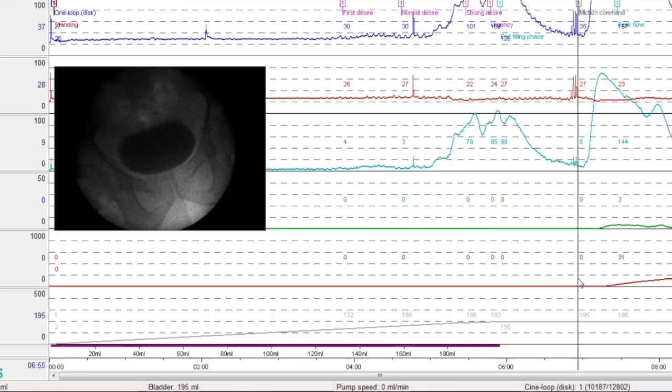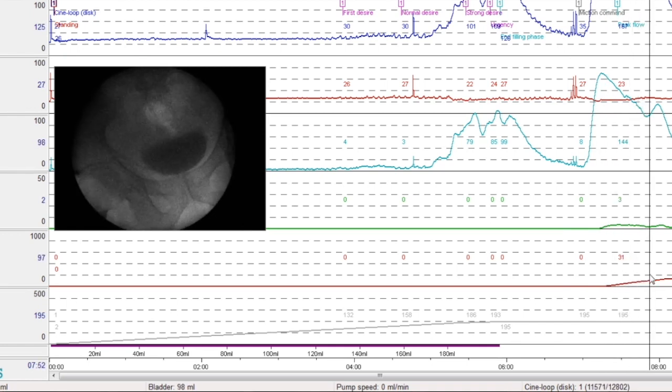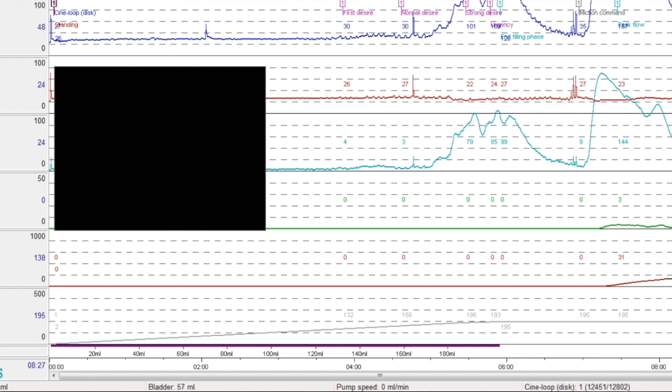Now you can see this video-urodynamics study, and what is apparent here is that when the patient tries to pass urine, you can see there's a very high pressure generated, and yet the flow of urine is very slow. It's as if you're sitting in the room, you're pushing at the door very hard, but the door is opening very slowly, and that tells you that there's an obstruction. But what the video part of the study does is, it tells precisely where the location of the obstruction is.